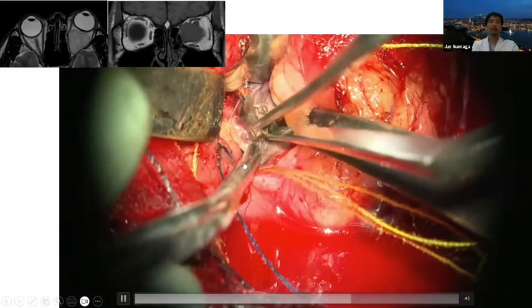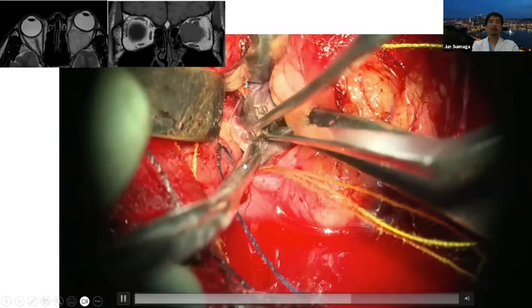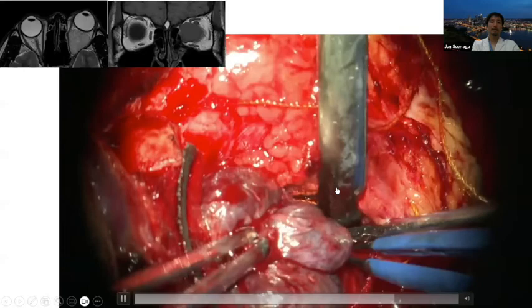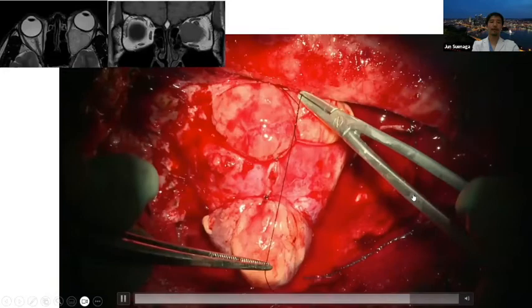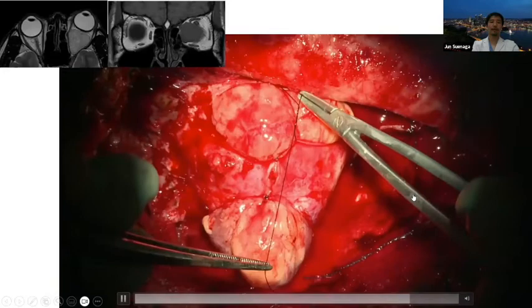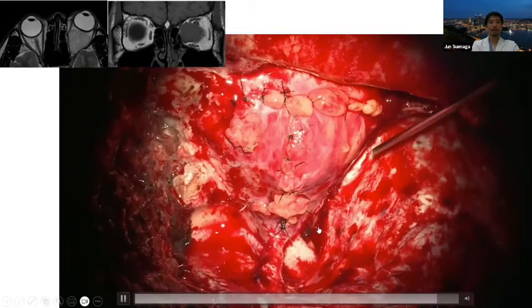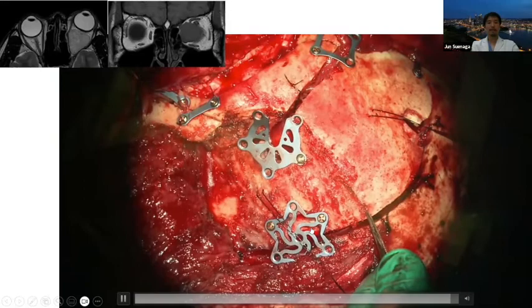All the angioma is removed. Suture using 6-0 nylon as much as possible — I think this is enough cosmetically. Using the titanium plate and hydroxyapatite for reconstruction. Postoperative patient photos show: before surgery there was exophthalmos and visual function at almost light perception level. After surgery, eye movement is fully recovered and the wound looks good. This is also a large case with exophthalmos and diplopia. The optic nerve position is very important when choosing the approach, and visual function was preserved with the approach chosen.